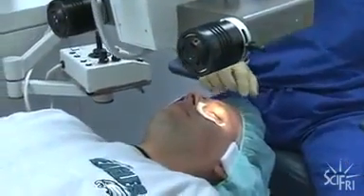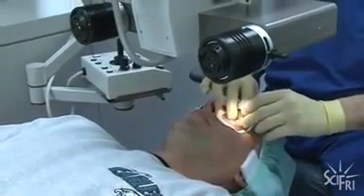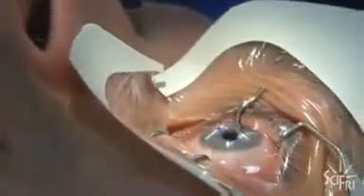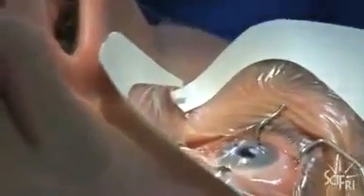So there's numbing medication topically placed in the eye a couple of times. And we put sterile drapes on the eye to keep our field clean. And then place the speculum to hold the eye open. After the speculum, Dr. Vail marks the eye, which helps him locate the astigmatic axis in patients having an astigmatism corrected. The marker also helps Dr. Vail realign the flap that he's about to cut. A LASIK flap is a piece of stromal tissue that we cut from the cornea but leave attached by a small hinge. So you do the treatment inside and then put this piece of tissue back over.